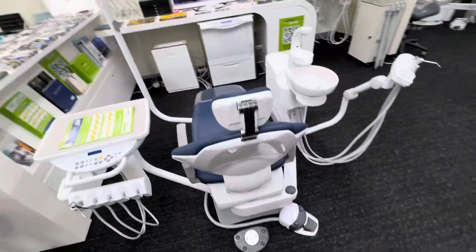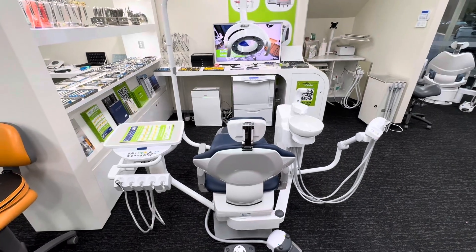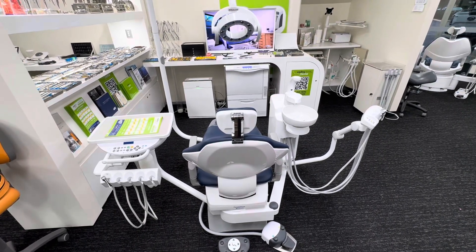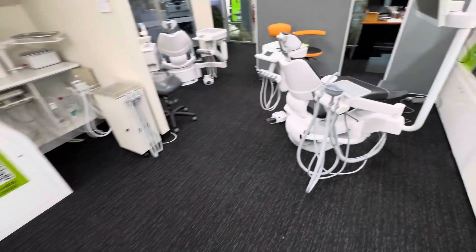We can go into our mid-range here, which is the Belmont TB Compass — that's a left-right convertible. You can also get the same model in an over-the-patient, used to be in a knee break. This model is phasing out; this is one of the last in the country in the TB Compass. The Clester 2 is still available in the over-the-patient, but we are moving across to the Eurus range.